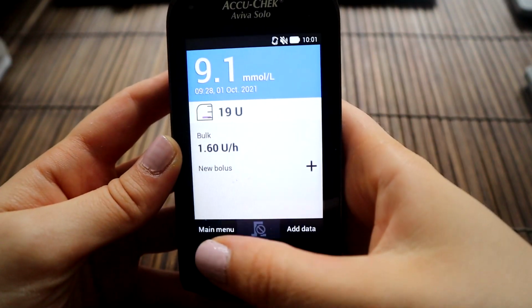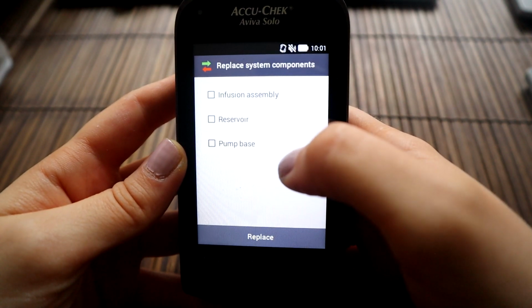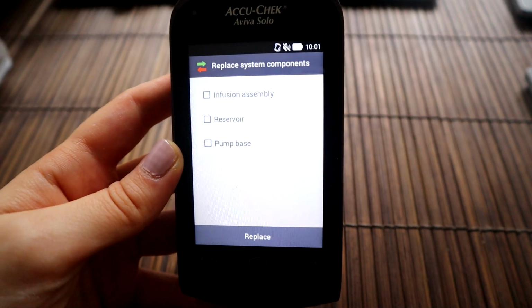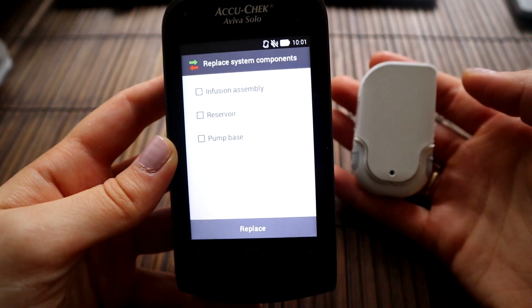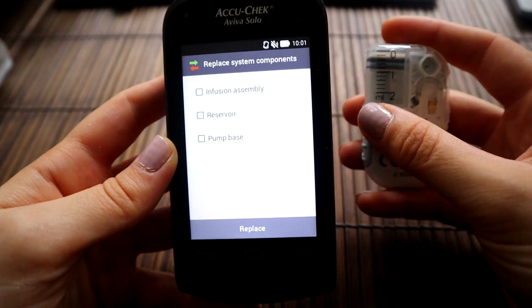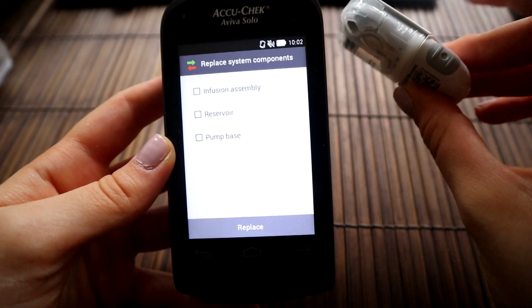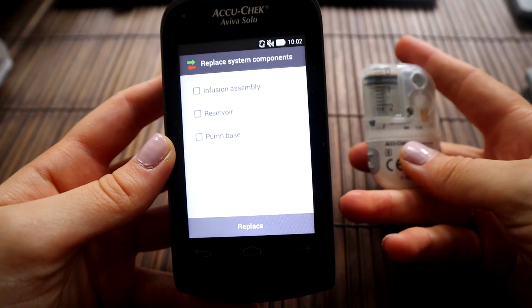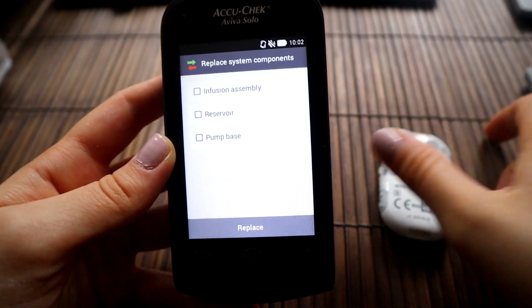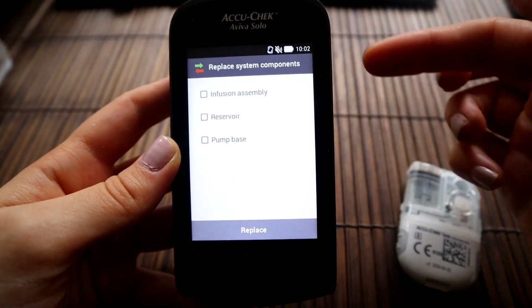Okay, so this is the home screen. We go to the main menu, replace, and then you have the option to replace the infusion assembly, the reservoir and the pump base. So I've just taken my pump off of my arm site, and this is what the actual pump looks like. If you can see here, this whole section is the reservoir, and then this is the pump base where a lot of the electronics, I think, are inside, and you replace the actual pump once every 4 months. I haven't done that yet, but you just have to scan this QR code with the thing on here. There's a camera on the back.